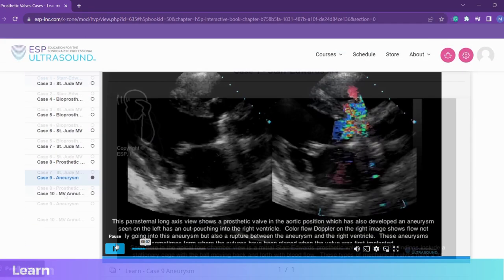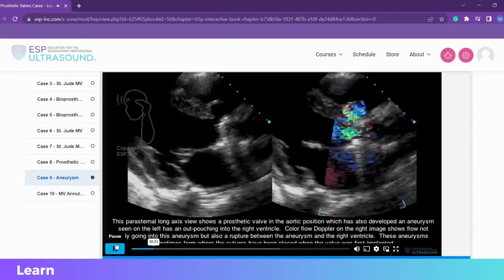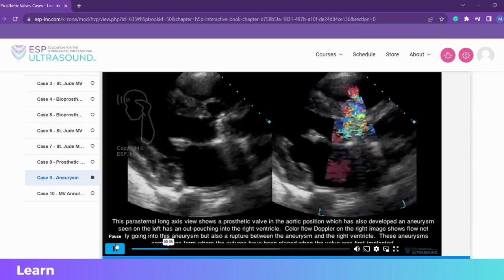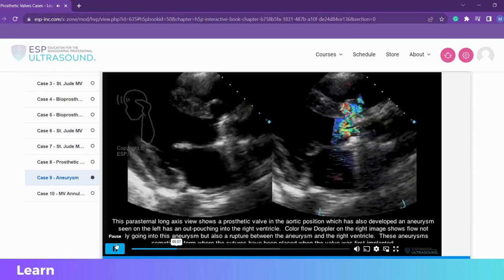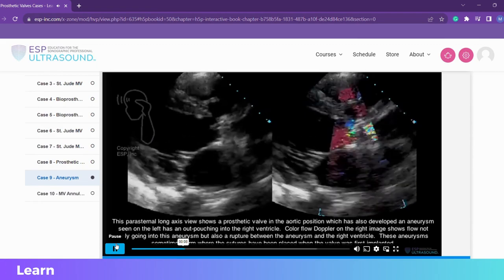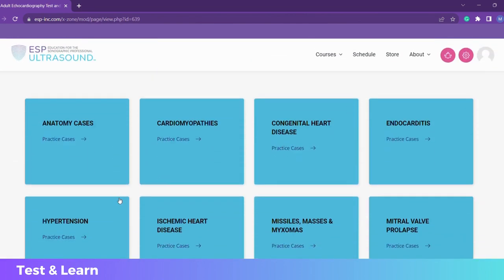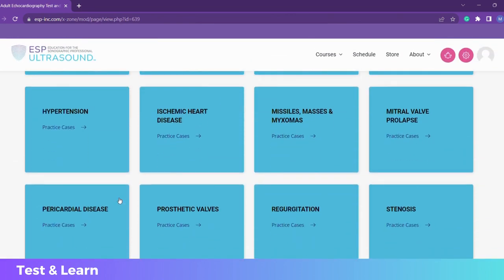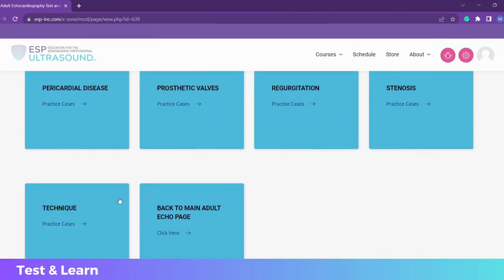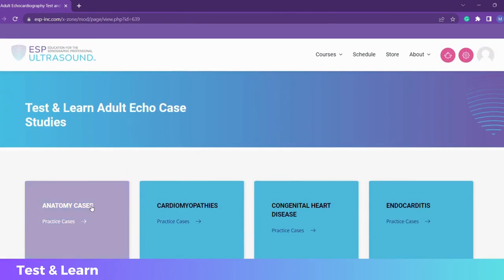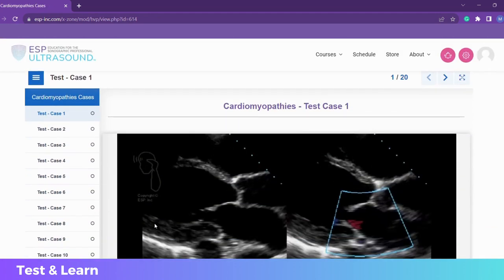This parasternal long axis view shows a prosthetic valve in the aortic position, which also has developed an aneurysm seen on the... Or click on 'Test and Learn' to view the video clip first, and then check yourself by listening to our expert describe the ultrasound findings.